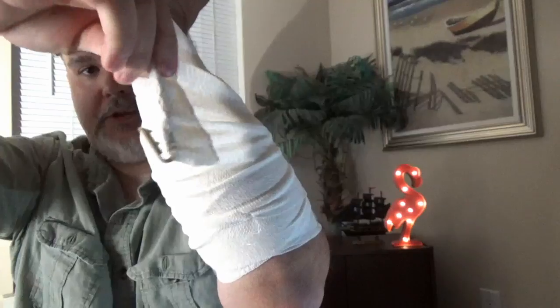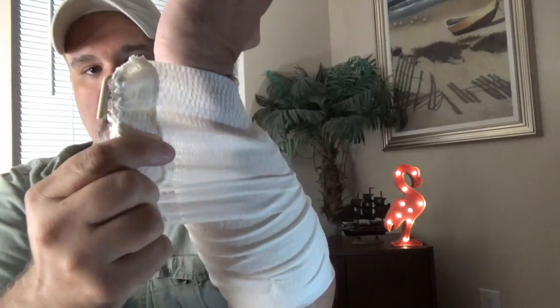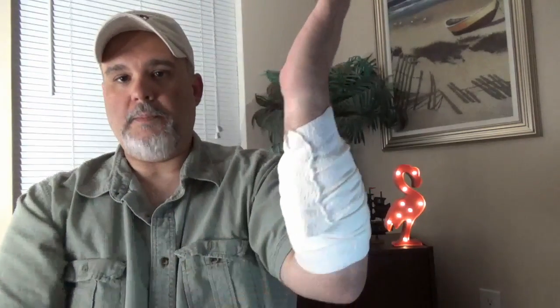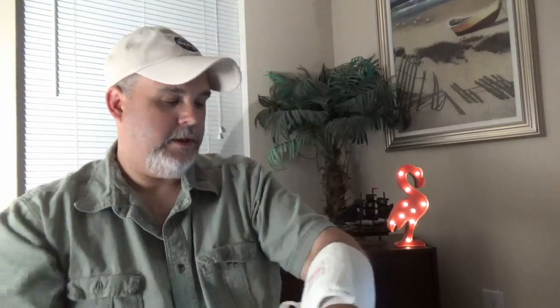When you get to the end, you've got this little bar — it's double-sided with two ends. Pry it open a little bit, take it, lock it in and lock it down, and your bandage is in place. Bleeding is going to be controlled, and this works absolutely fabulous — it will hold in place as long as you need it to until you can get to definitive care. I've talked about how to apply the bandage, but I haven't talked about when to apply it.